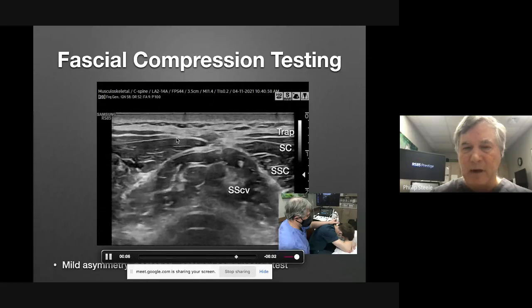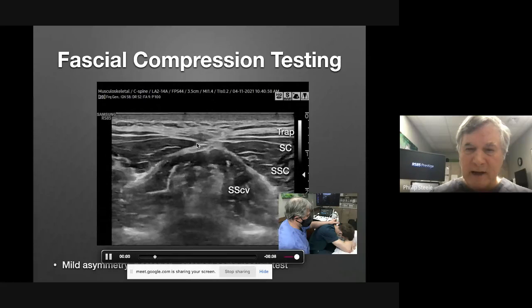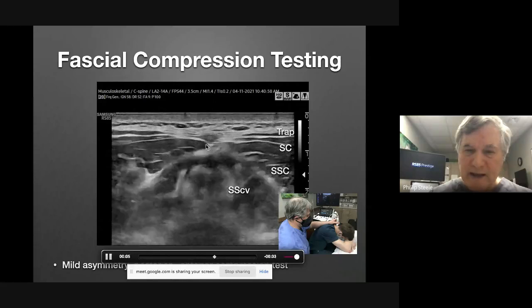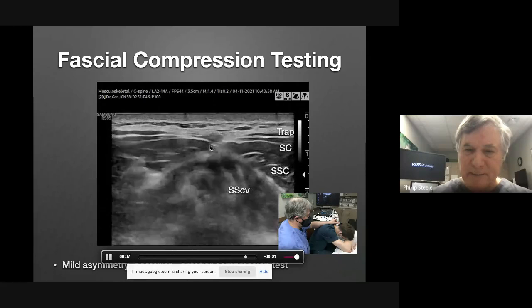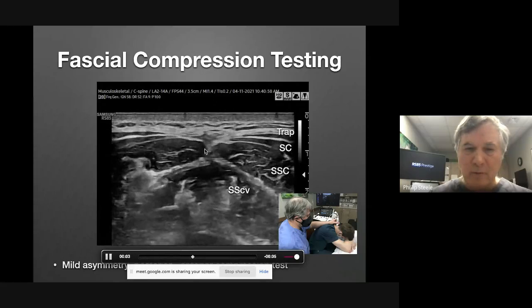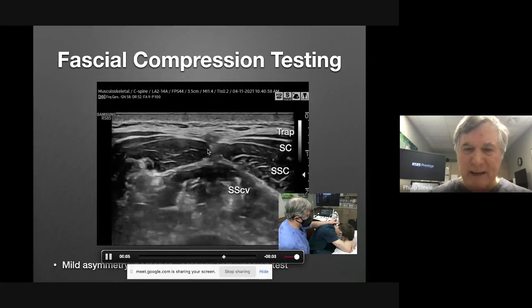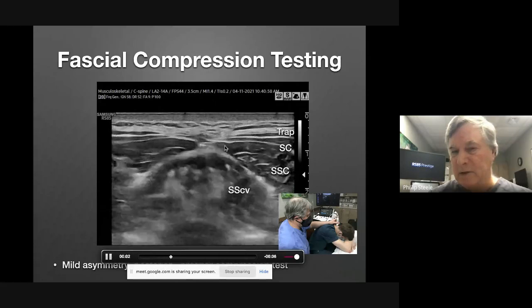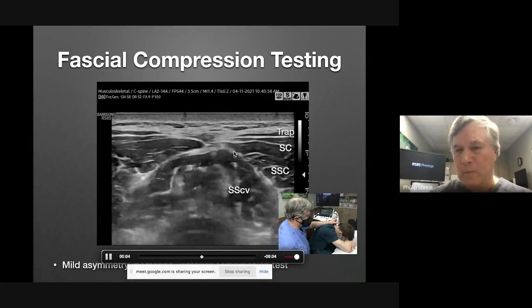If I look right here, I see that the muscle stretches and thins, but it remains attached to the septal portion here. As I go back and forth, very little movement of this semispinalis capitis is occurring at this level. All the movement seems to be laterally here, okay?